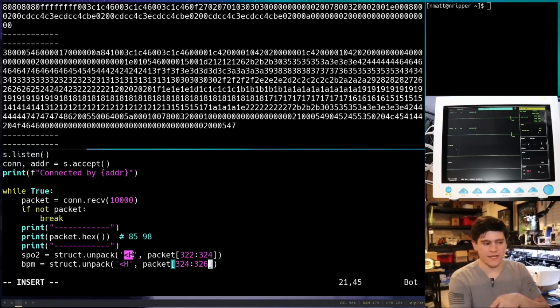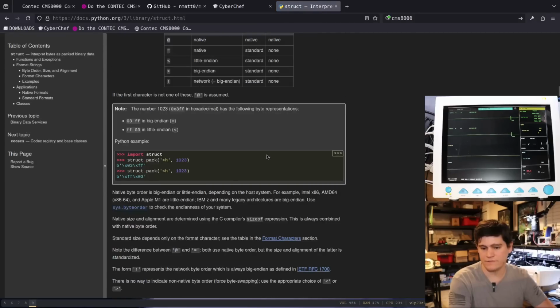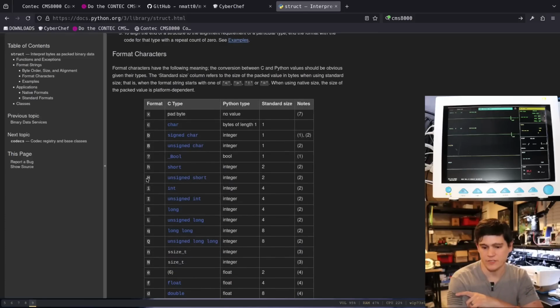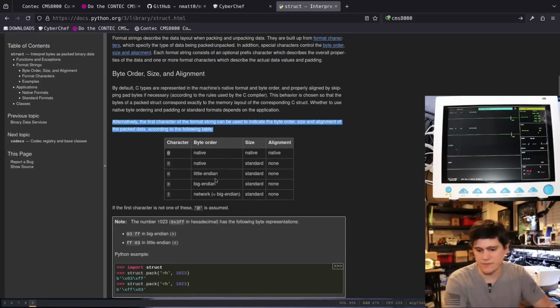Now, what is this? If we go to Python struct, this is a very cool thing, which lets us parse a lot of different common data types. And here is this fancy little table that says an unsigned short, which is a 2-byte integer, is specified by this h value. And then there's the angle brackets. What the angle brackets are doing is specifying the endianness. So we're going to specify little endian, but that doesn't seem right. Actually, I think we want to do this. Well, let's experiment.